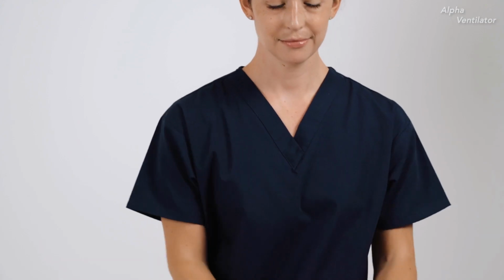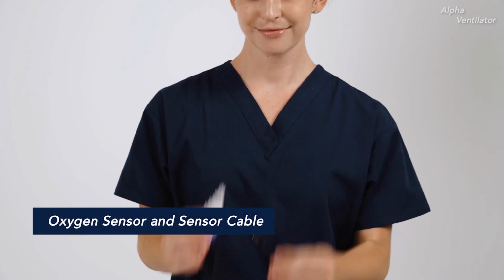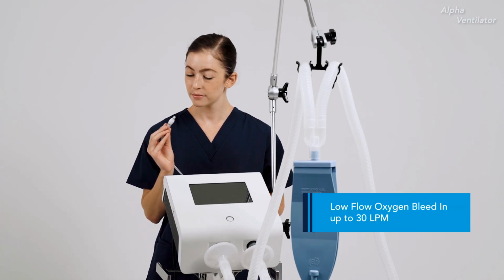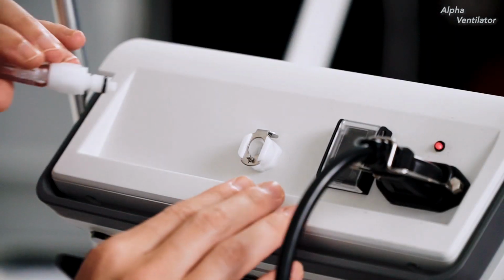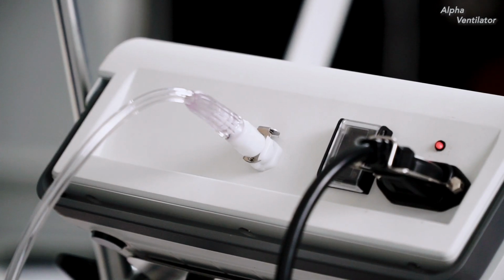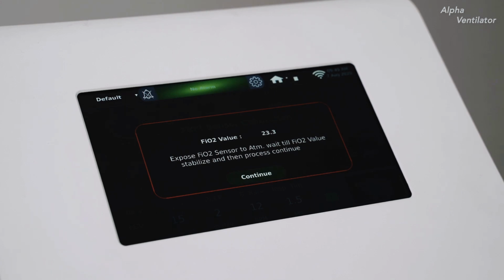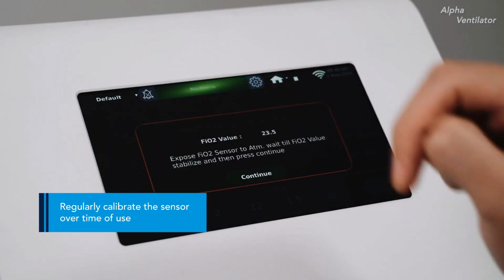The ventilator accessories include an oxygen inlet adapter, oxygen sensor and sensor cable, and a T-piece to mount the sensor. You can bleed in low-flow oxygen up to 30 liters per minute through the low-flow oxygen inlet at the back of the ventilator. The inlet adapter clicks when secured. Don't turn on the flow until the ventilator is powered on, and make sure that the flow is turned off when not in use. If you're connecting the sensor for the first time, follow the simple steps on screen to calibrate the oxygen sensor. You may have to regularly calibrate the sensor over time of use.